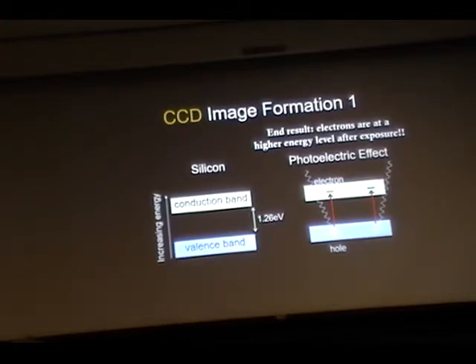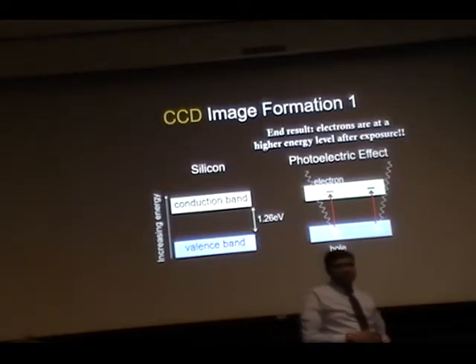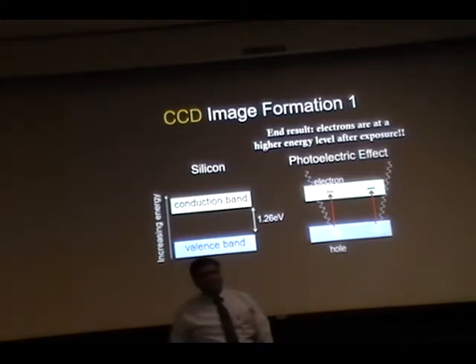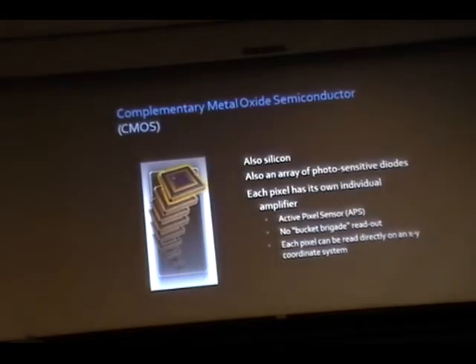We talked about photoelectric in an earlier instance, but that was dealing with the patient, right? Remember? There are 4 types of interactions that are happening. You guys remember? Sam, do you remember? No? So that's why I keep a comprehensive exam. So photoelectric is the effect that is happening on the sensor end.